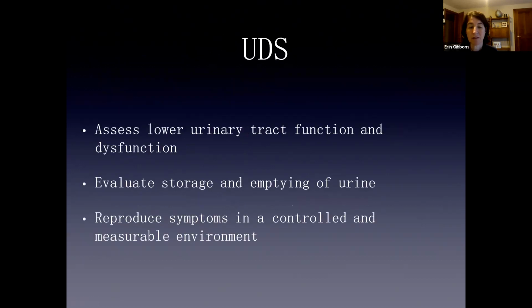So urodynamics, generally using it to assess the lower urinary tract function and dysfunction abnormalities. Obviously, the lower urinary tract, the bladder, is for storage and emptying of urine. And really, I think the idea of urodynamics, especially in my practice, is trying to reproduce what the patient is telling you is bothering them, so that you can see if there's something pathologic going on and give them an idea for treatment.